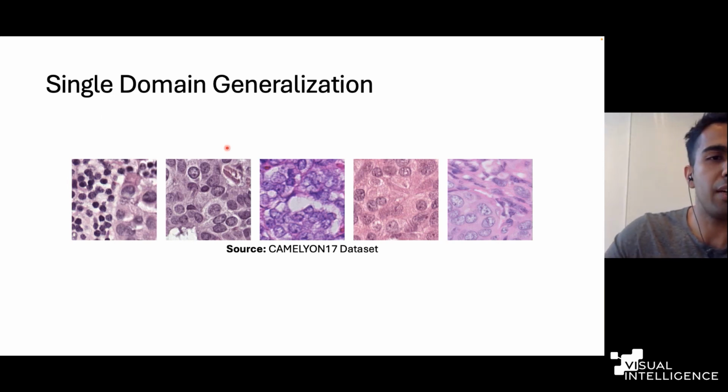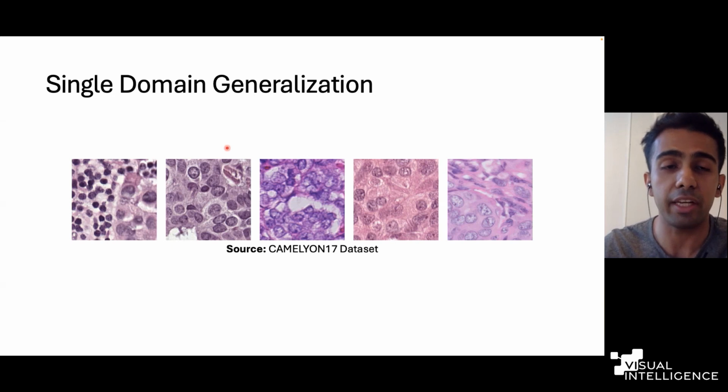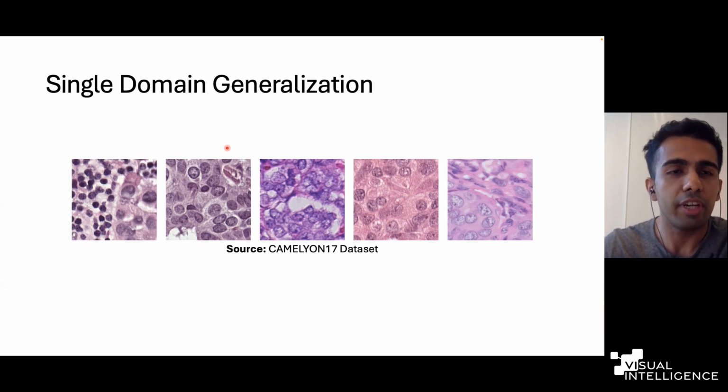Which is also a bit more practical because with hospitals, even if you're working with the same cancer type, the data varies a lot from hospital to hospital, and of course also from country to country, because of the way people stain the tissue, how they create slides, how long you wait to stain, and many other things, and the scanner you use. So in our paper, we are considering a hospital to be a domain, which is a very restrictive setting.